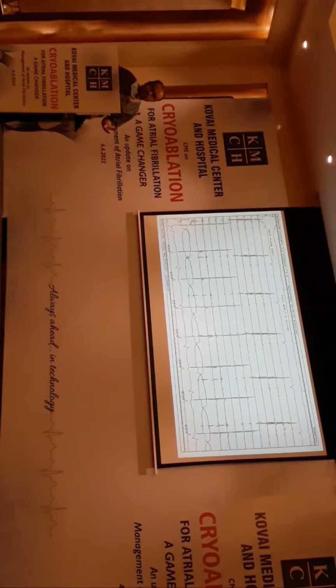So what we usually do is, the moment we see an isolation, we have to make sure that there is no more connection between these two areas. You can do entry and exit blocks. You can pace from the coronary sinus and put a catheter in the pulmonary vein and see if this pacing potential gets conducted to the pulmonary vein, or you can pace from the pulmonary vein and see if that potential comes to the left atrium. We call it entry and exit blocks.